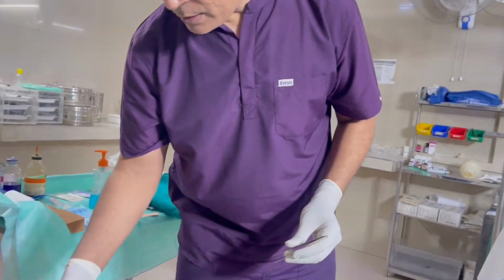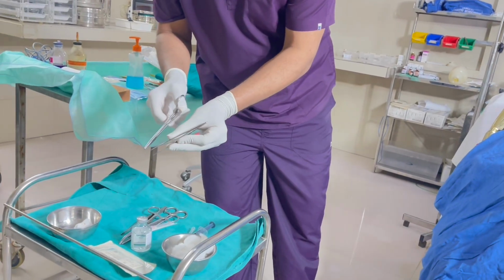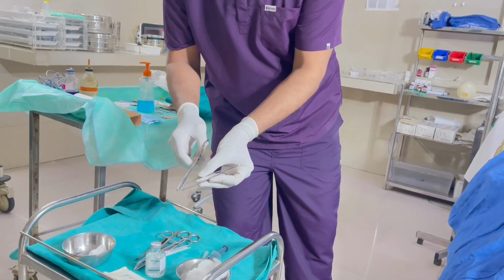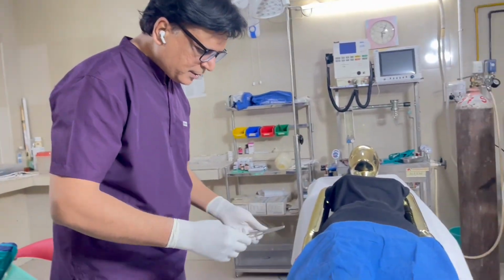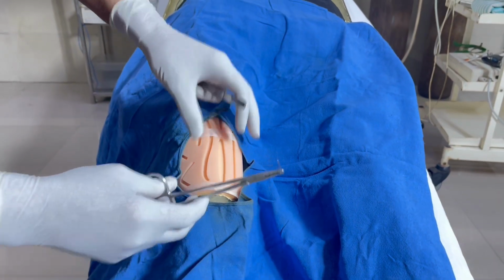So then I just take my suture material. This is monofilament. I will be suturing this wound in this manner.